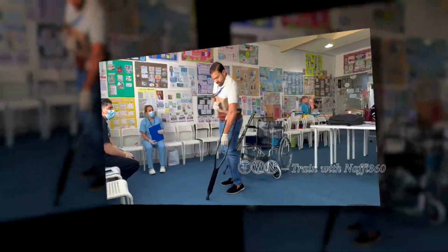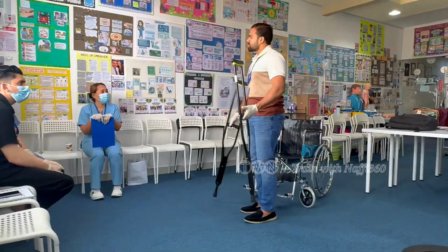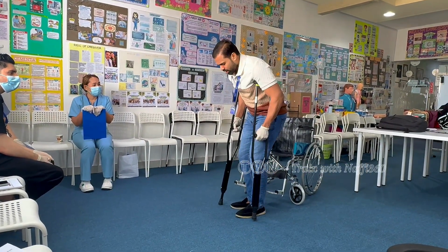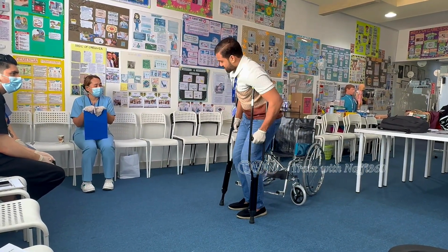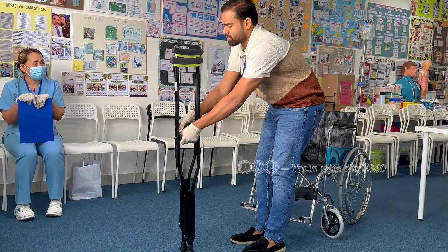Also remind the patient to maintain an upright posture and body balance to prevent falls. Remind the patient to be careful on uneven surfaces, wet floors or carpets. Teach them to look ahead and not just at their feet.